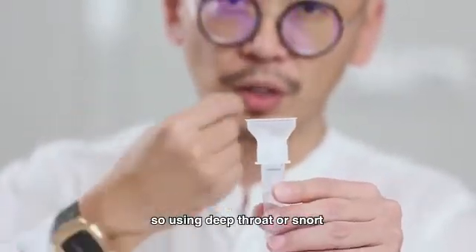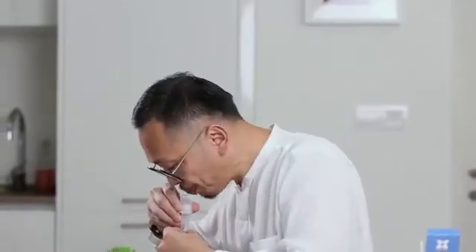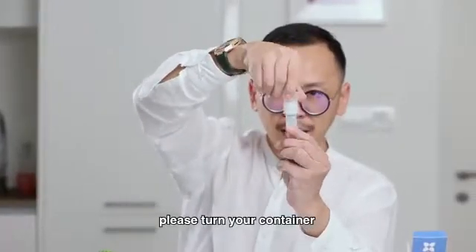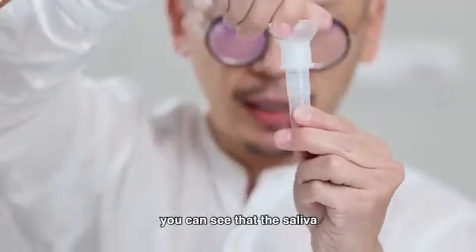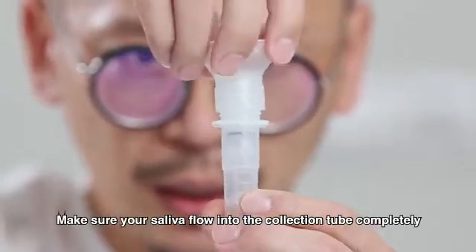Using a deep throat or nasal swab. And please turn your container — you can see the saliva. Make sure your saliva flows into the collection tube completely.